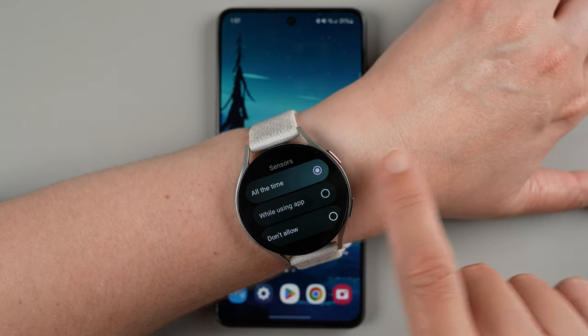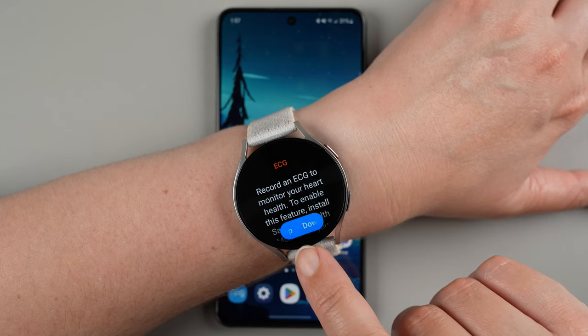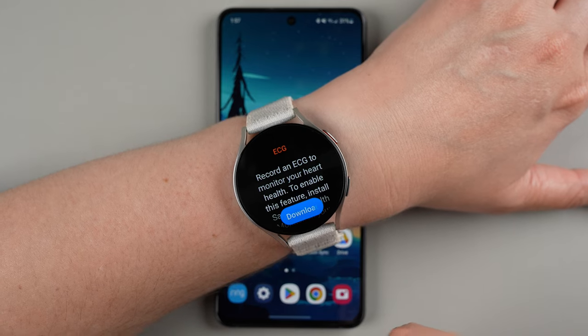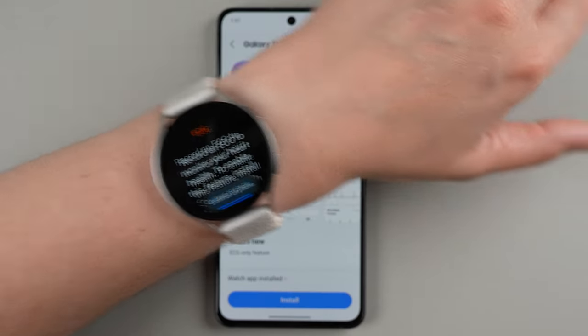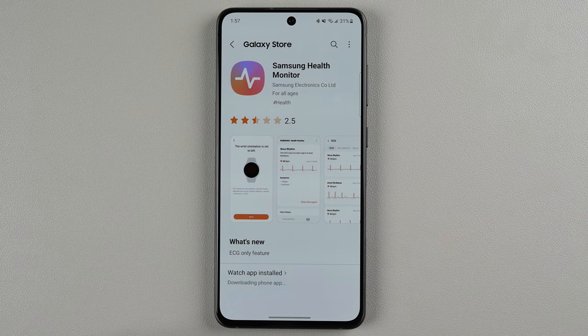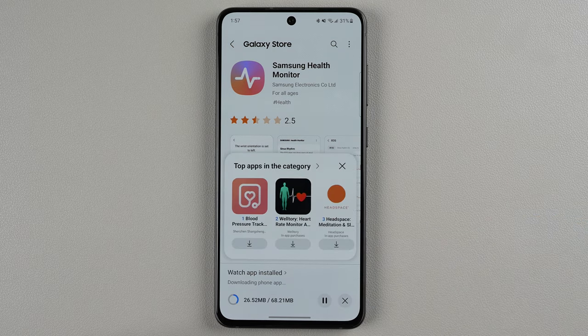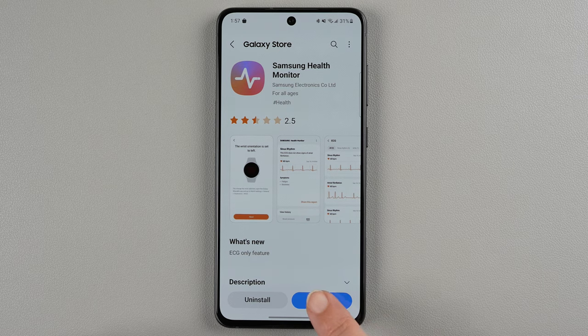Now if I swipe to go back, it's saying download the app. So there's an additional app you'll need to download to your phone. If I tap this here, it says continue on phone and you can see here now it has the Samsung Health Monitor app. All you need to do is press the install button and it will work to install the app to your phone. Now I'm going to tap on open.